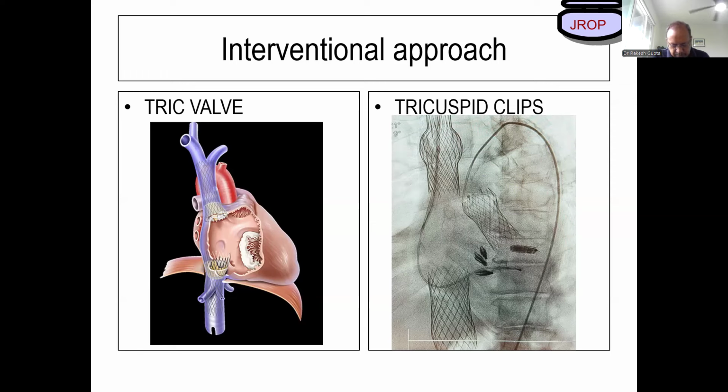So, when we were done, I was thinking there is RV infarct, but when echo was done, was it RV infarct or LV infarct? It was RV infarct. It was RCA, the right coronary, causing posterior wall and inferior septum infarct on echo. ECG also showed that, but the patient was in shock.